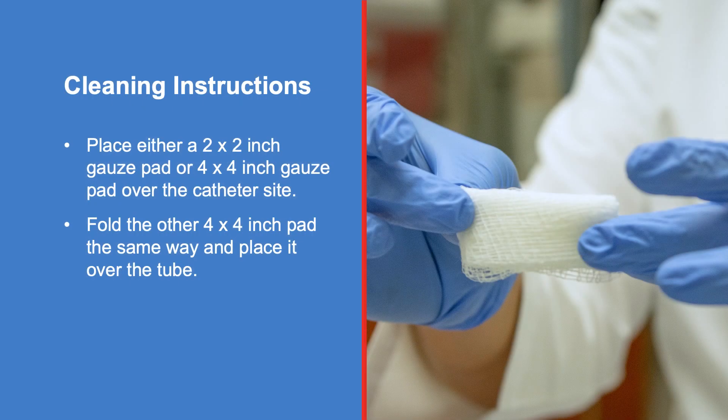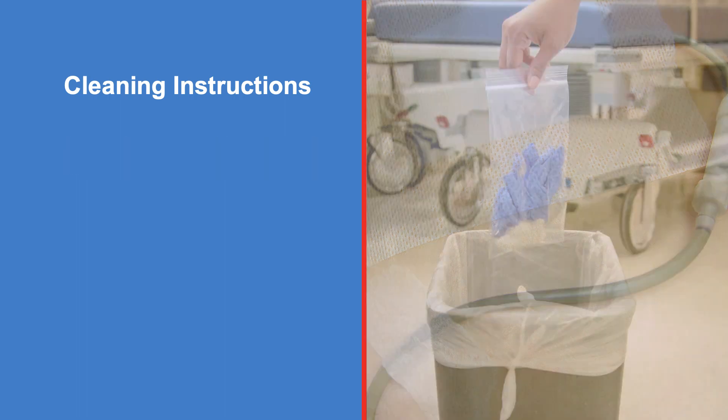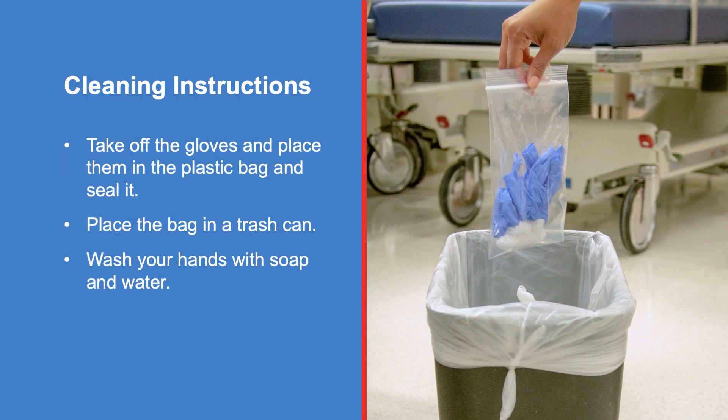Place either a 2x2 inch gauze pad or 4x4 inch gauze pad over the catheter site. If using a 4x4 inch pad, fold the pad in half. With the folded edge up, place it under the tube. Fold the other 4x4 inch pad the same way and place it over the tube. Cover the gauze with a piece of cover roll tape or Covaderm. Take off the gloves, place them in the plastic bag, seal it, and place the bag in a trash can. Then wash your hands with soap and water.